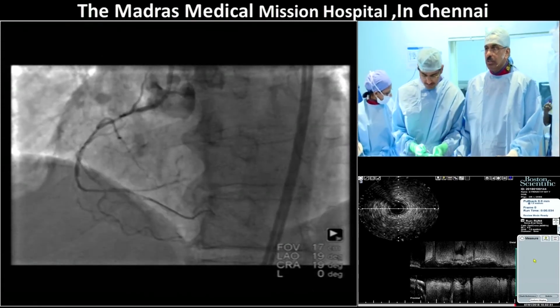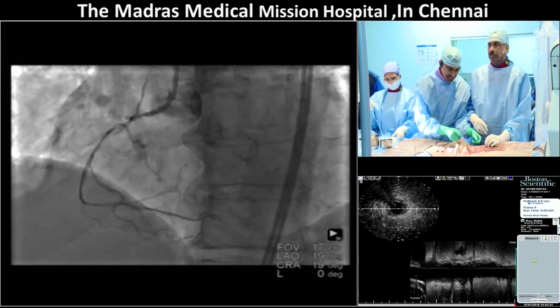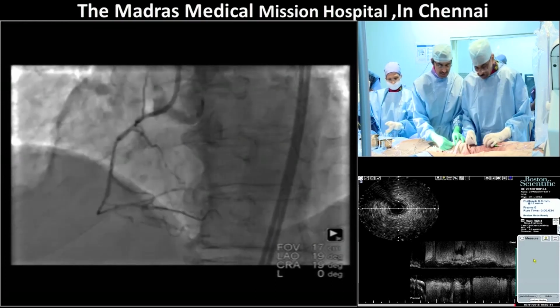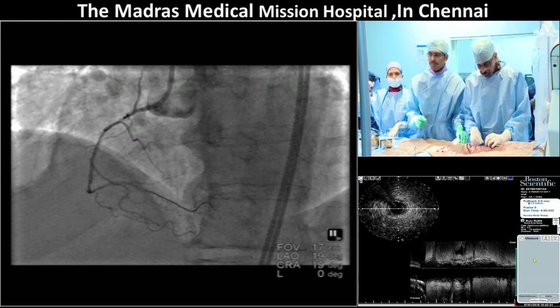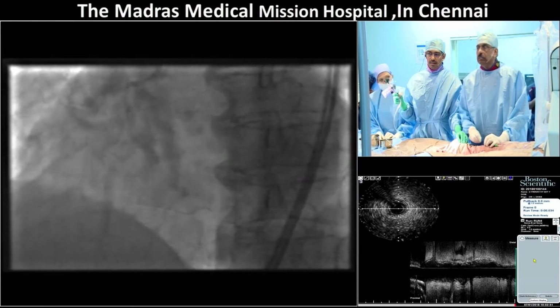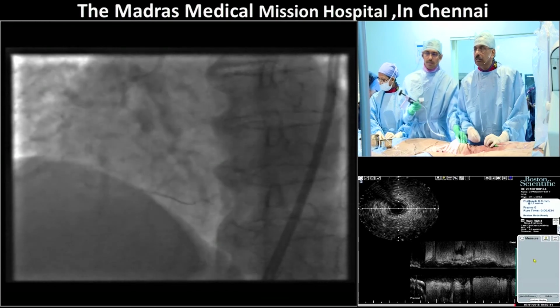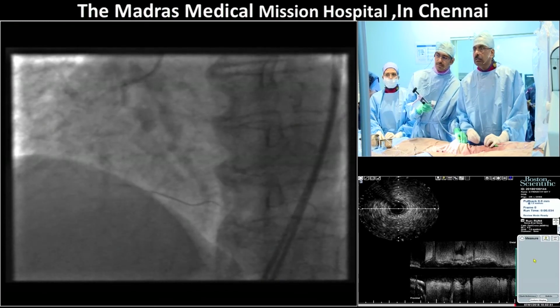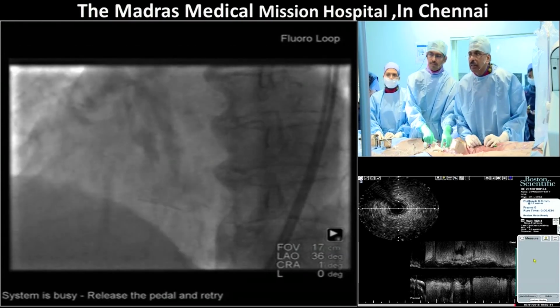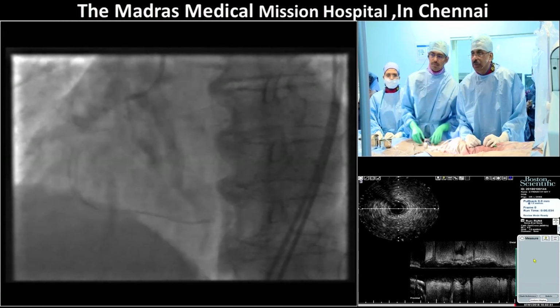Okay, so we had all the issues related to CTO here. Another question, Ajit, when you had gone into the acute marginal before getting into the true lumen, at that time, could be because the wire was beyond the occlusion, could we have dilated with a 1.1 millimeter balloon at that stage itself? Because the proximal portion of the occlusion was more severe than towards the acute marginal branch, and then opening the proximal half of the CTO and then taking an antegrade injection and a floppy wire at that stage, was it an option? No, I'm just asking for a discussion case. I really wouldn't do that. Okay.